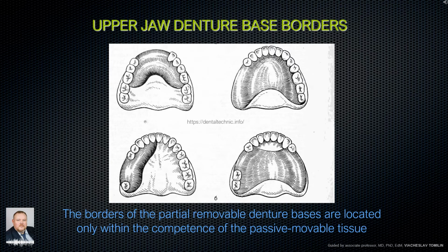On the buccal and vestibular sides, toothless areas of the alveolar process, the border of the prosthesis takes place 0.5 to 1 mm below the mucogingival junction, avoiding the movable buccal alveolar strands of mucosa and lips frenulum. The distal prosthesis edge does not reach the vibration line, line A. Maxillary tuberosity must necessarily be overlapped by the prosthesis. This is an essential condition for fixation and stabilization.